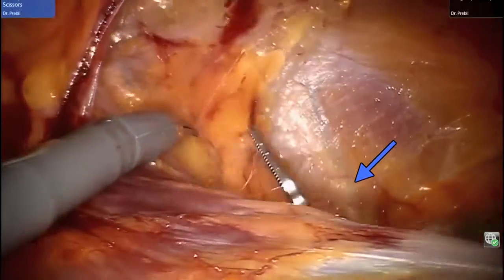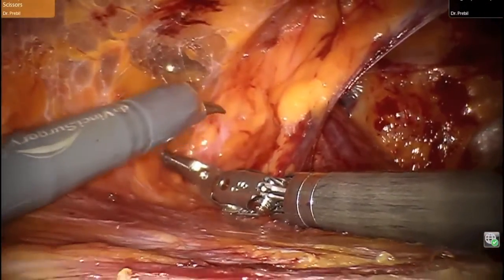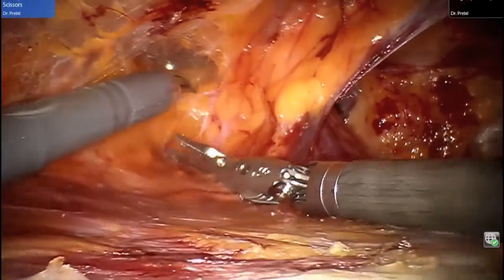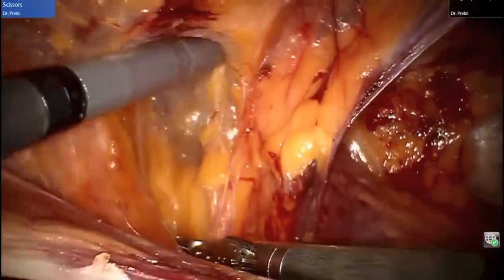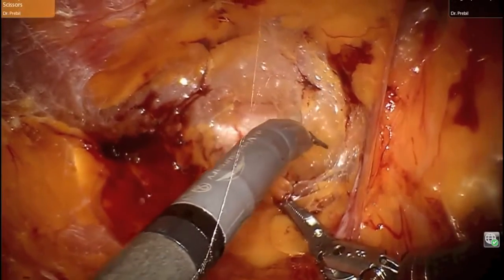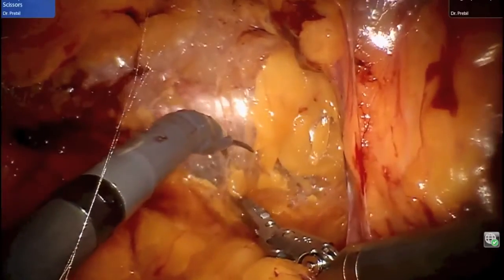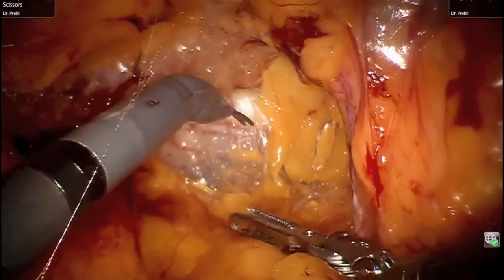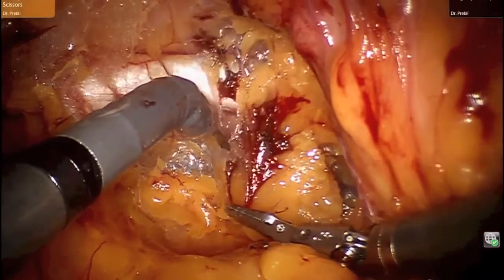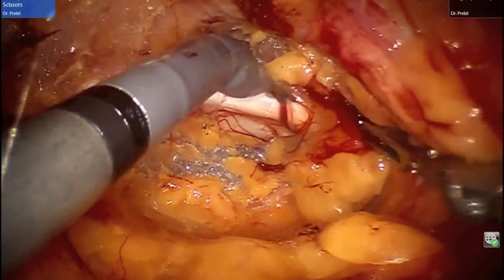This view reveals the genital branch of the genitofemoral nerve. Medial to the hernia sac, Cooper's ligament is exposed. The corona mortis overlying Cooper's ligament is also exposed to avoid inadvertent tack injury.